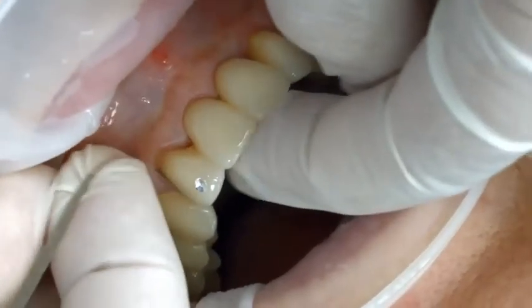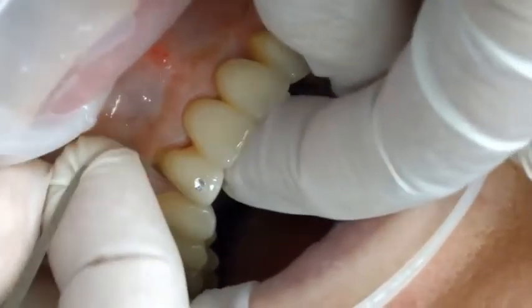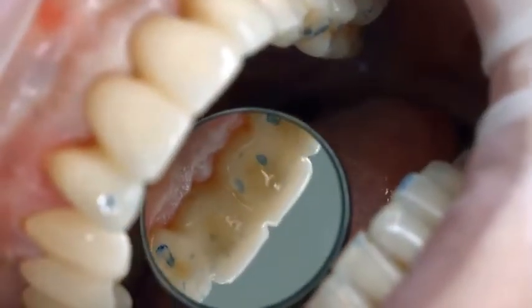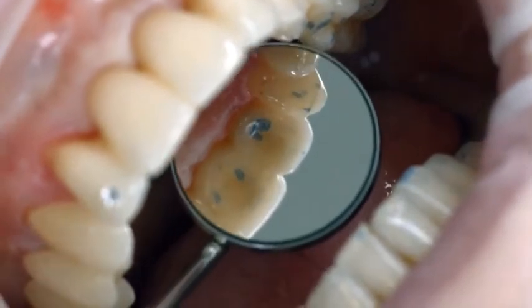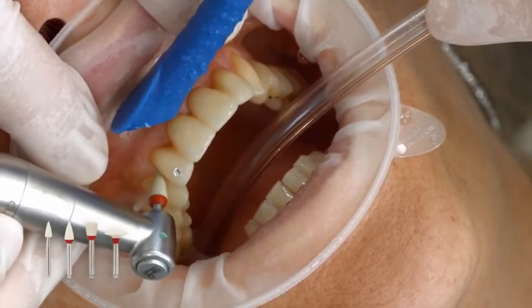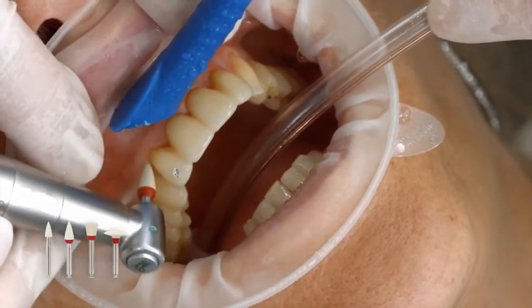Finish the proximal surfaces using finishing and polishing strips. Check the occlusion and functional movements in the process, and make adjustments if necessary. Polish the restorative margins with polishers, such as Optra Pol, or with discs.